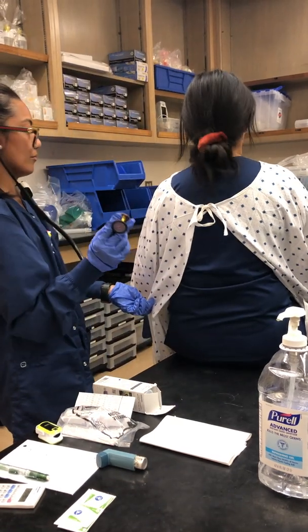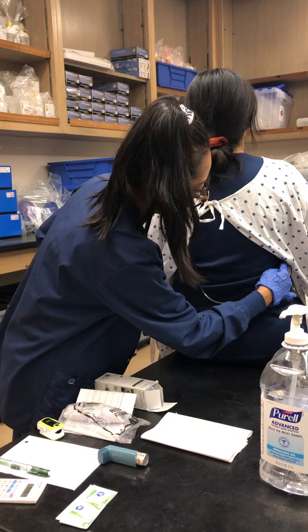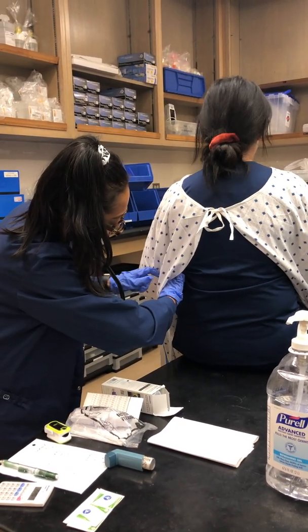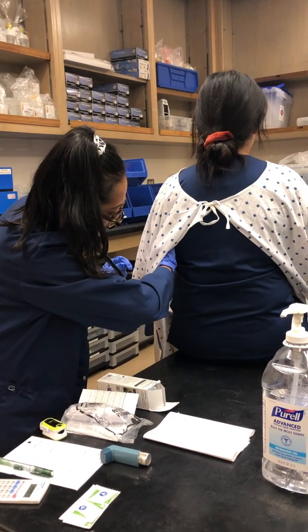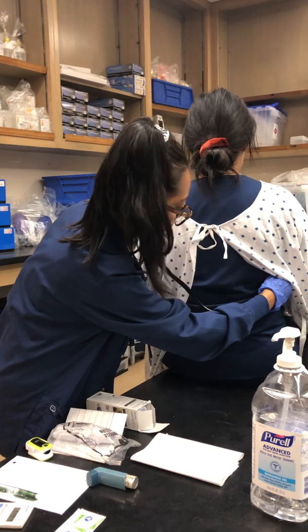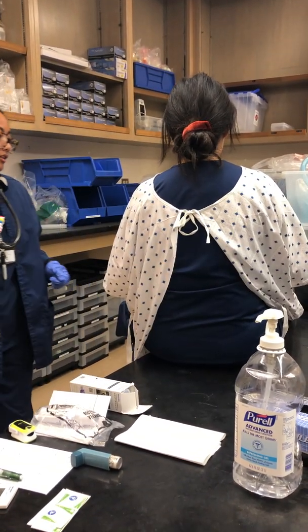You're still doing okay? Yeah. Okay. Okay, go ahead. Okay. Okay. And one more. Go ahead. Okay. How are you feeling?